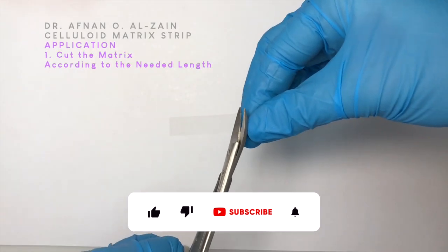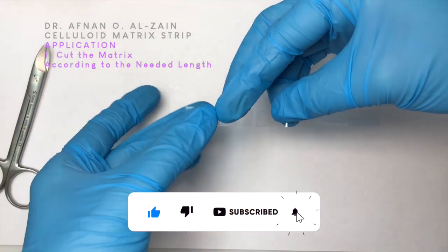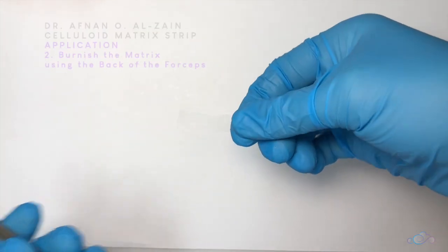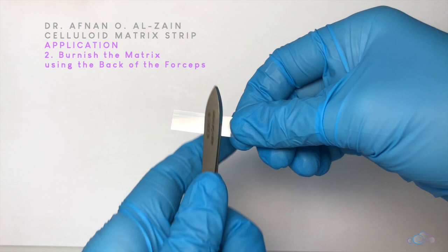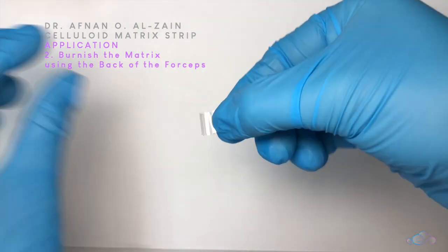We are going to burnish the matrix with the back of the forceps. We run the strip along and pull it into the top of the forceps up to the edge. This is how you burnish the celluloid matrix.